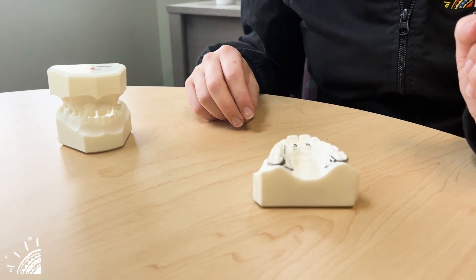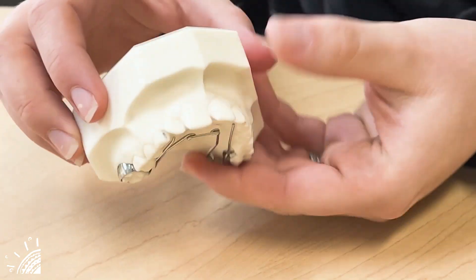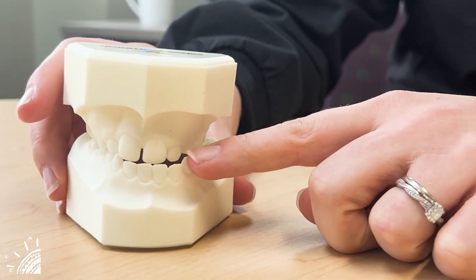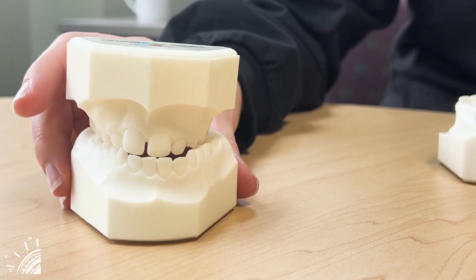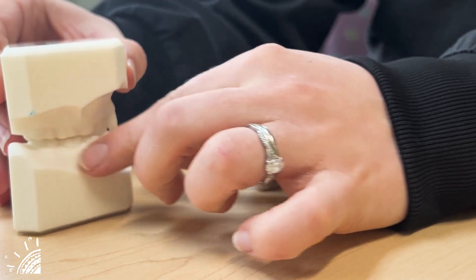Quad helix is an appliance utilized to widen the upper arch. Here I have an example of what we would be correcting. Sometimes when that lower arch is out wider than that upper arch, an orthodontist may recommend the use of this appliance to allow that bite to then fit together properly, more so what we're seeing on this side.